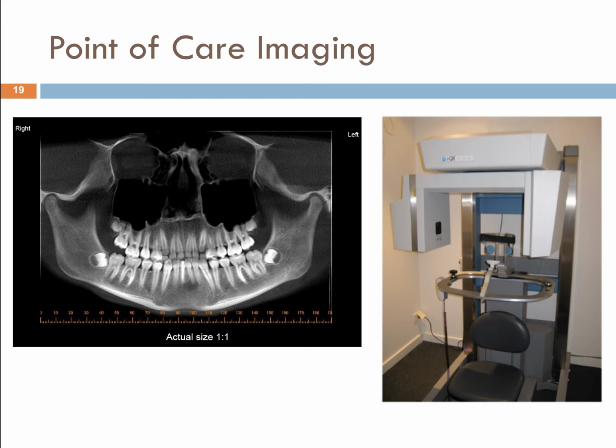Very popular for that. And I'll finish off, because I talked about point of care imaging. I think that's one of the things that will change a lot as we go further into developing imaging: the software that can be used on the images that are acquired, but also that point of care. As you can see up on the screen here, this is the cone beam, the dental unit that I was talking about before, something that costs $200,000 rather than $1 million.